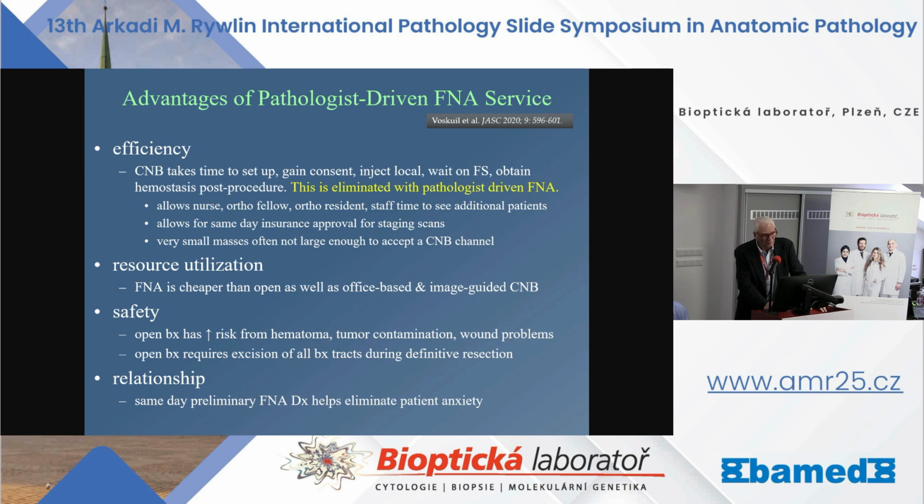I typically do 3 passes, and remember, with each pass, I rinse the needle in RPMI to obtain a cell block. If it's very sclerotic, and I look at how much material I'm getting out onto the smear, sometimes I'll do a 4th pass in some cases. So this allows them, while I'm doing that, to see other patients. It allows the nurse, the orthopedic fellow, the orthopedic resident, remember it's a teaching hospital, so we have fellows, we have residents, and allows the staff to see additional patients in different rooms while I'm doing the FNA in that room. It also allows for same-day insurance approval for staging scans.